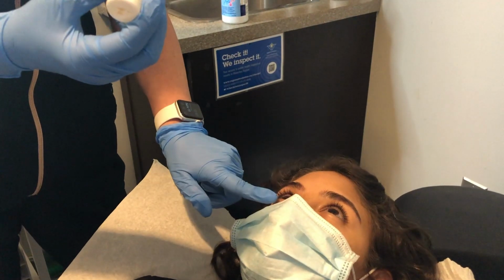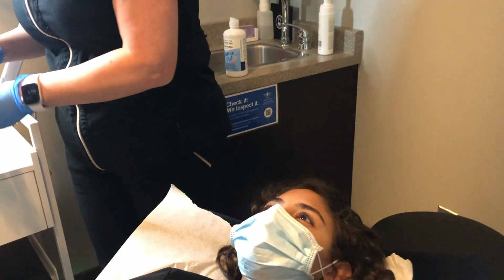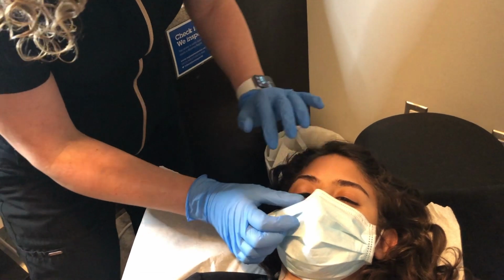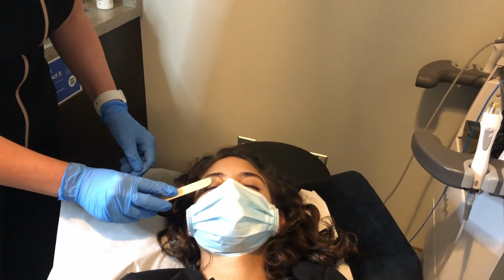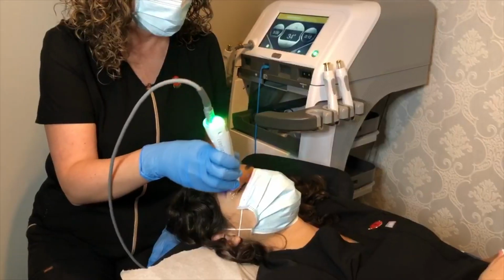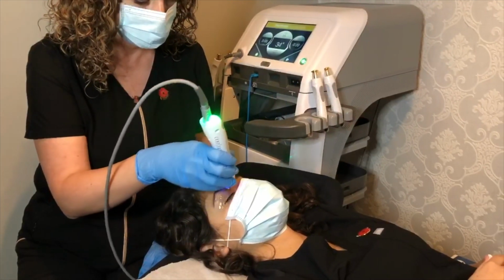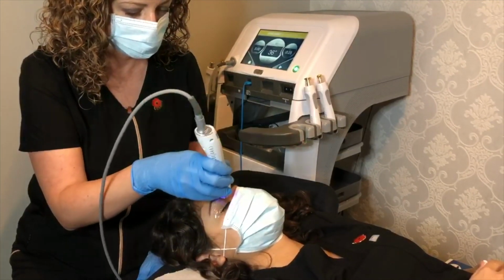At first, we have our patients reclined and we instill some freezing drops to make the patient more comfortable. Next, a protective contact lens shield is placed into the eye that protects the eye itself from excessive heat. We then apply ultrasound gel to the lid before treatment. Next, heat is applied via radio frequency, one lid at a time. Once a desired temperature is reached, we stop heat application and manually express the meibomian glands.